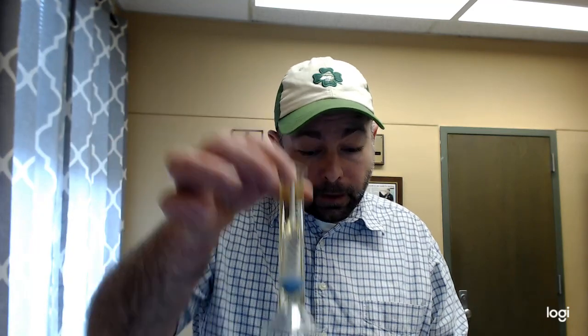Now, there's a section in your lab handout. I'm sorry, it's behind me. In your lab handout, there's a little section that tells you how to read these. And in fact, one of your homework assignments this week is I've got a lot of practice opportunities for you to read a virtual urinometer probe. But you're going to record the reading that you get from the picture that looks like this thing under specific gravity 1 in your handout.